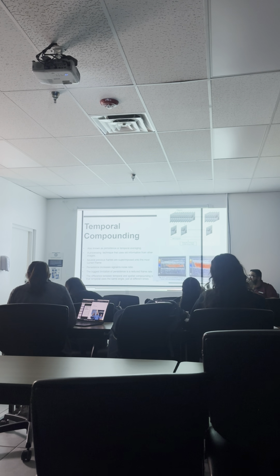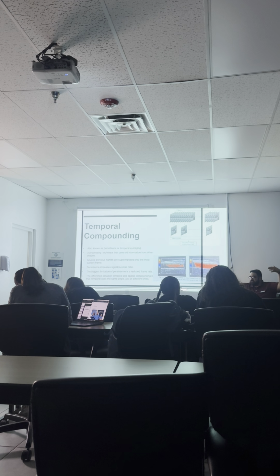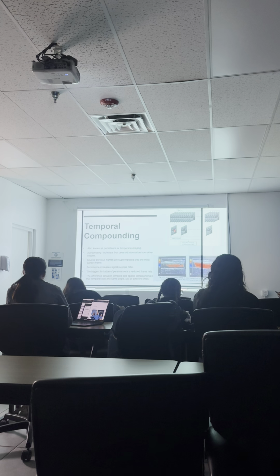Okay, that's exactly what's happening with temporal compounding. So it's taking a frame in time. Instead of in different directions of space, it's different moments in time. Okay, so from start to end, we can see here that each of these are frames, right? Yes. And this is a frame.